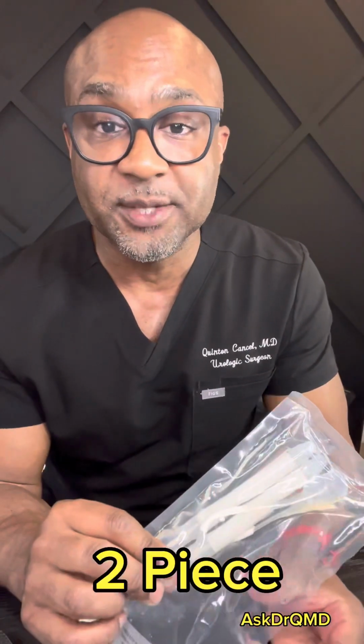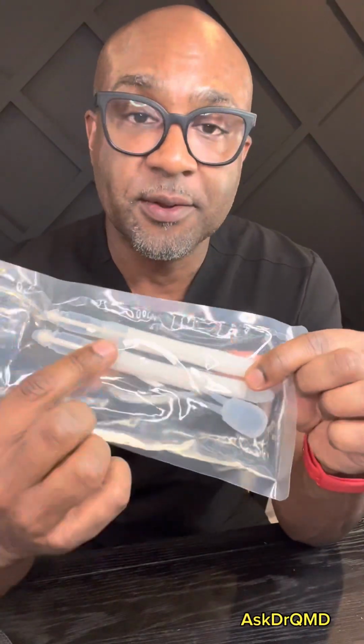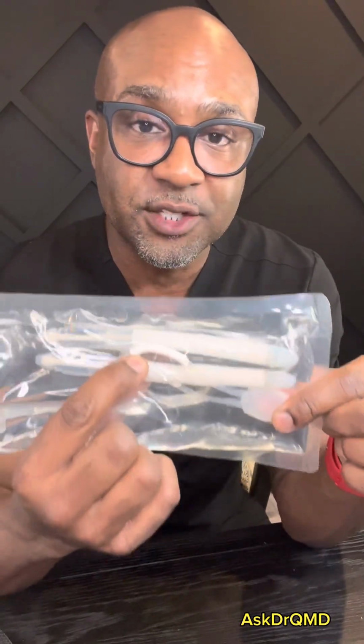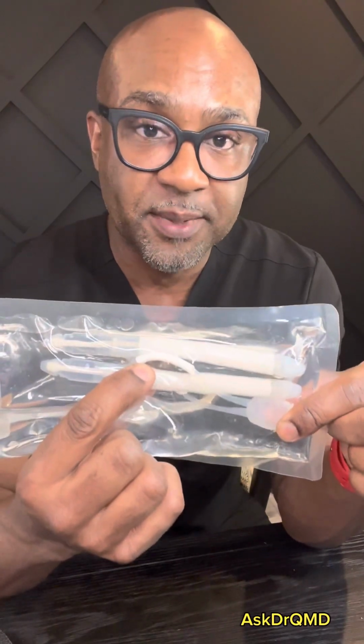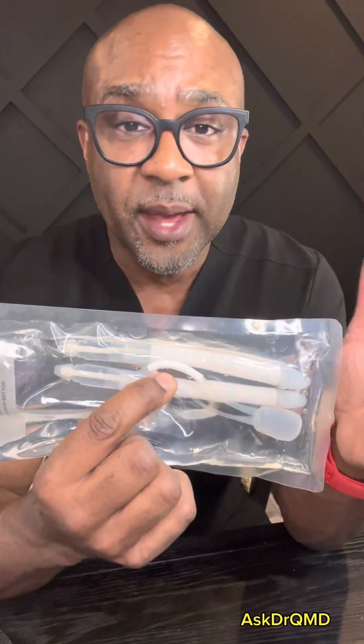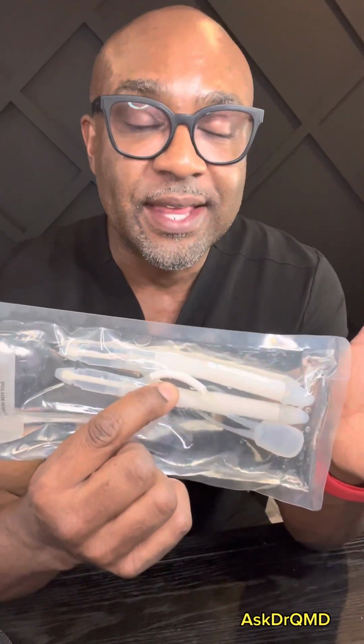The second of the penile prostheses is the 2-piece prosthesis. Now this is in a little saline pack in order to keep the fluid in it. But as you can see, there are only 2 components to this prosthesis. You have the cylinders and you have the pump/reservoir. This is different than the 3-piece because you don't have the big reservoir, and because of that, there's always going to be some fluid within the cylinders. That means you're always going to have a partial erection. So if that is an issue for you, then this may not be your prosthetic of choice.